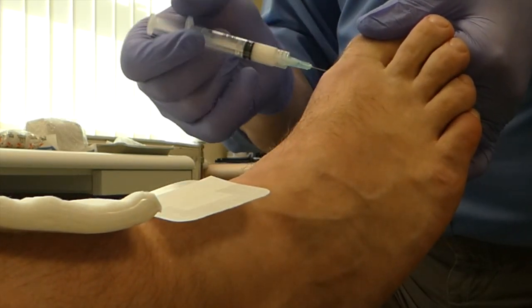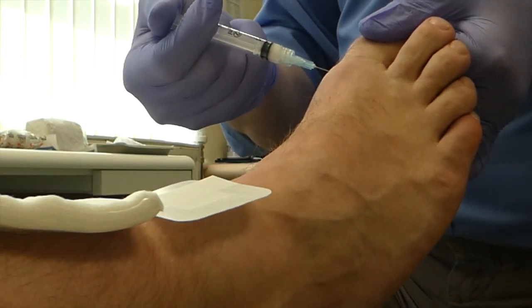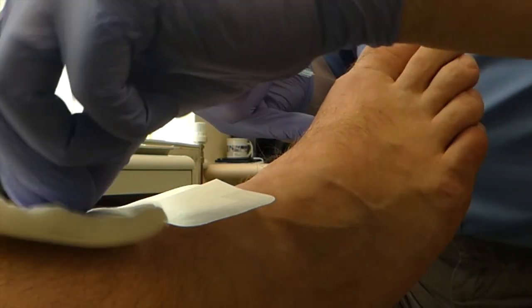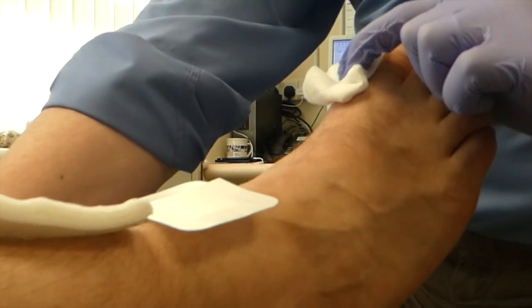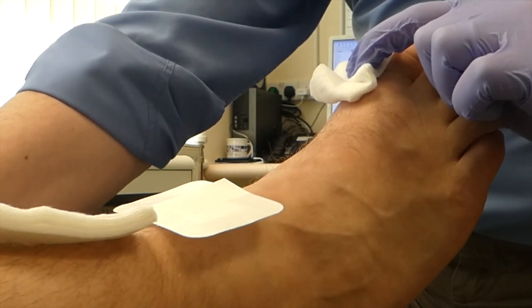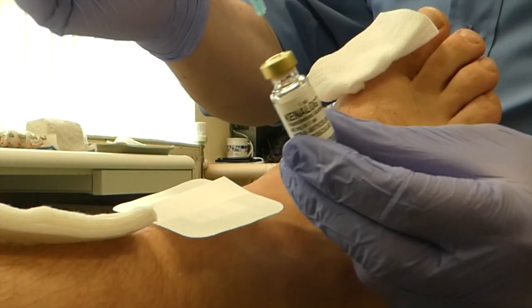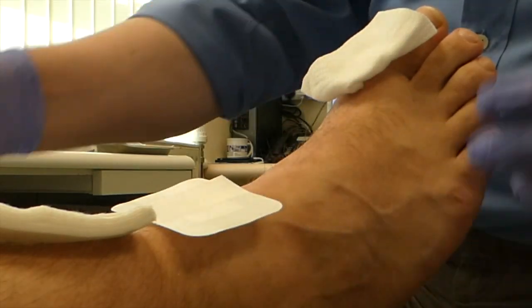Okay — my patient is pulling a face, and arguably I'm doing the same. That's going to come out and straight on, so there's no pressure. Nick is biting on his hand but he's doing very well — he's a bit squirmish, but he's quite strong and brave. This is my go-to technique for how not to resheathe the needle if you've only got one pair of hands — nice and safe.